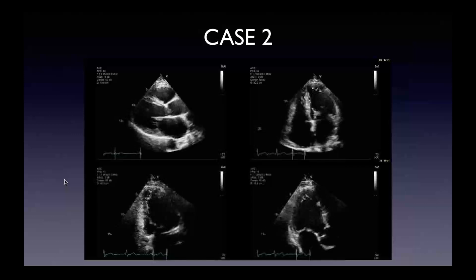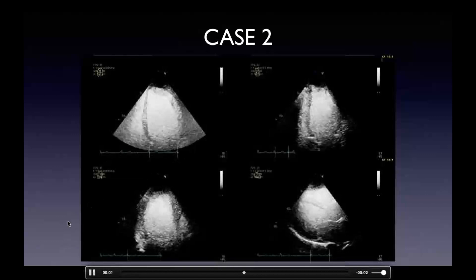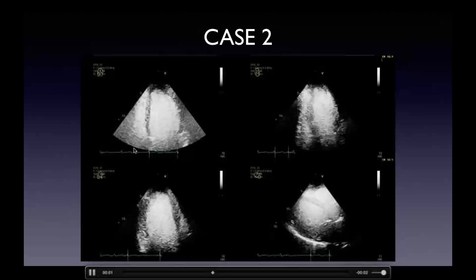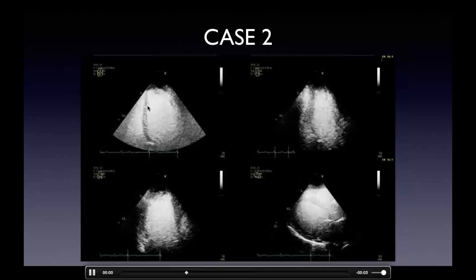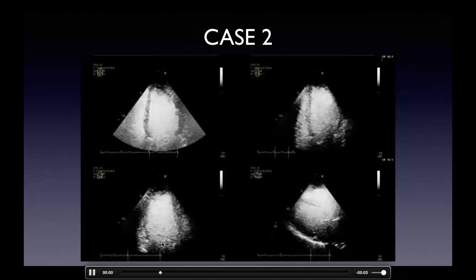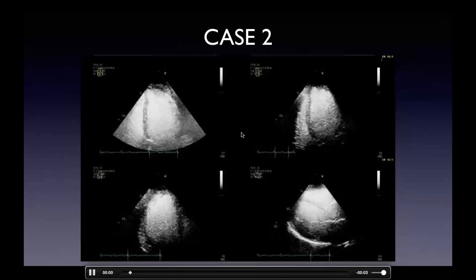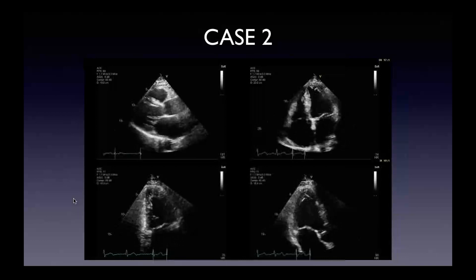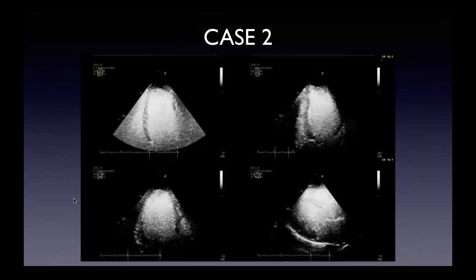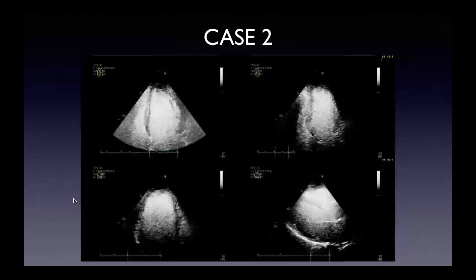On the GE system — perhaps not quite as optimized as Philips — this is actually a pretty good quality contrast image with dark endocardium and bright cavity. There's a bit of attenuation at the base of the apical three-chamber view, but you can actually see the endocardium fairly well. Based on this contrast image versus the non-contrast image, you can definitely see the endocardium better, can definitely trace better, and get better visual and quantitative assessment of LV ejection fraction.